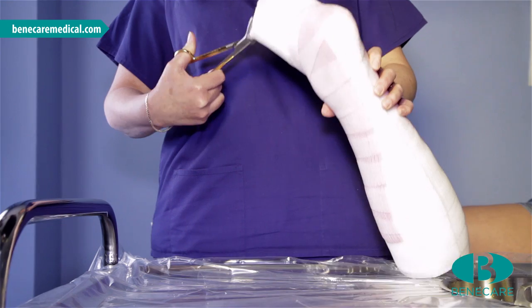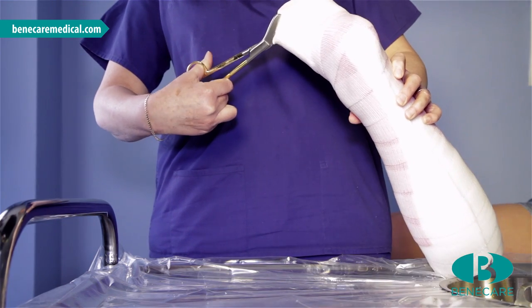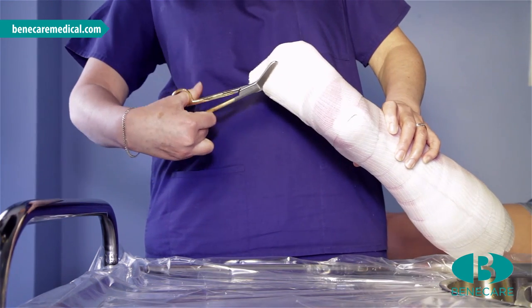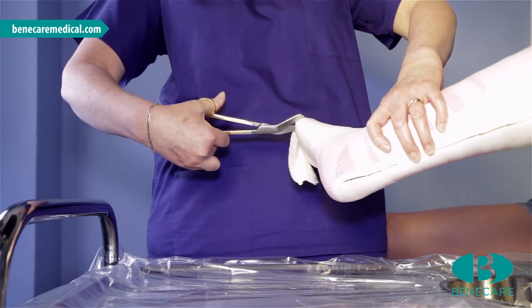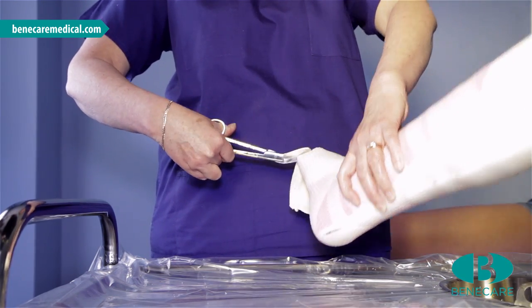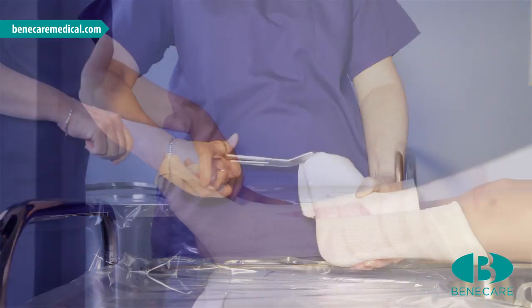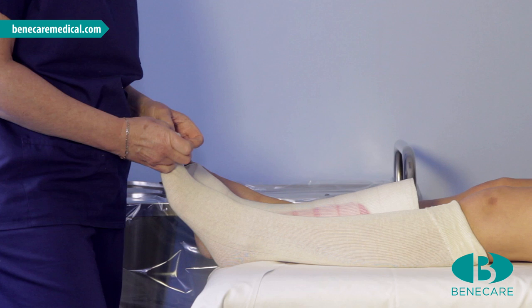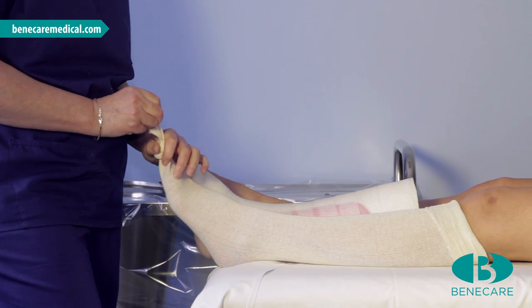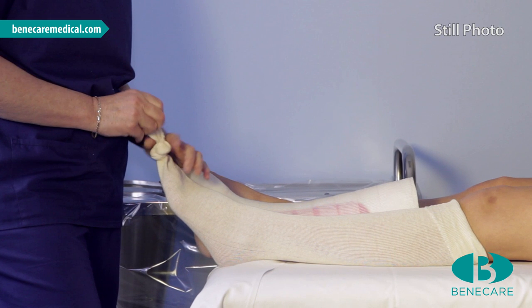Trim the cast at the proximal and distal end, making sure there are no raw edges. Tie a knot into the stockinette before reapplying the cast — this will prevent any ruching of the stockinette on the limb.